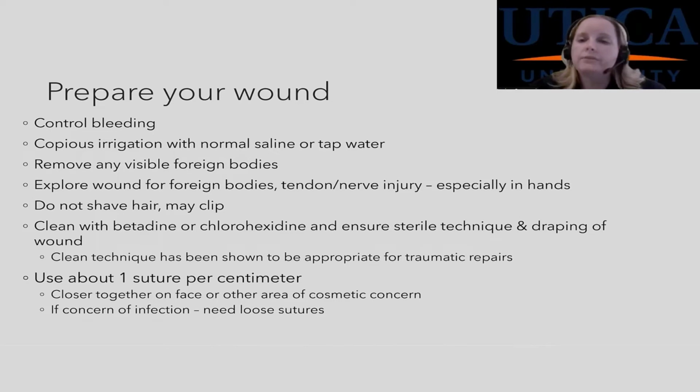So if you have an injury in their hair, you don't want to shave their hair. You could clip it, but usually just push it to the side, suture right through it, staple right through it. Clean the area with betadine or chlorhexidine, whatever your facility is using. You want to make sure you're using a sterile technique, drape the wound. Clean technique has been shown to be appropriate for traumatic repairs.